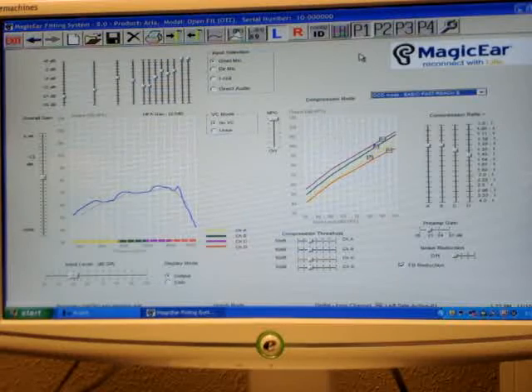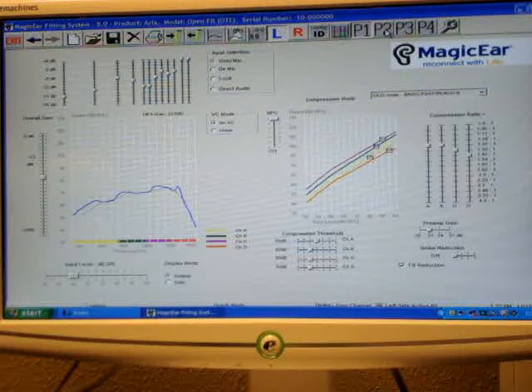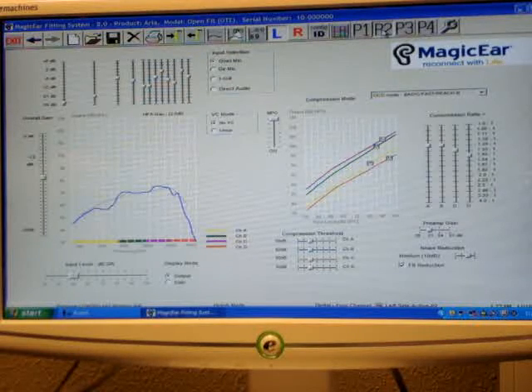Now we're in the program 1 mode. We can make any adjustments to the compression levels, the noise level slider, or we can go to memory 2. Low and high noise setting. Memory 2 automatically adjusts for more of a noisier environment, but we can slide the noise level. It will reduce the low frequencies.